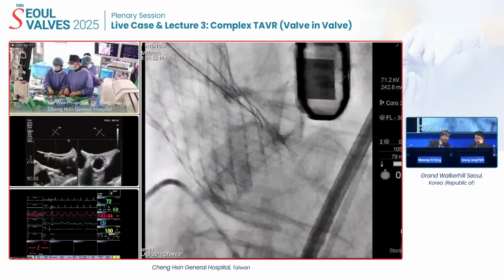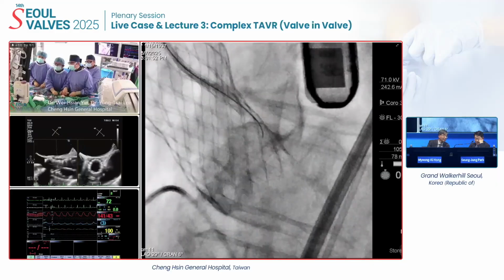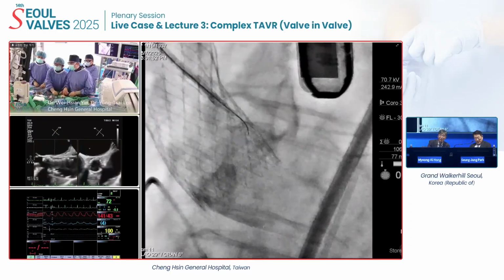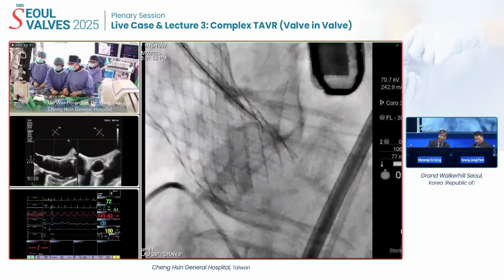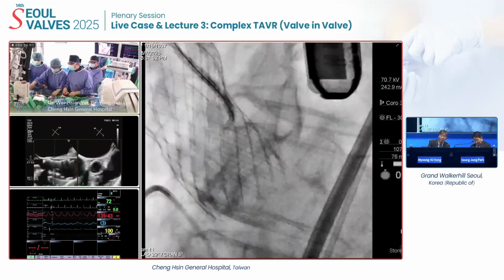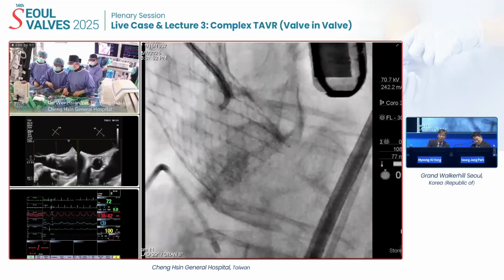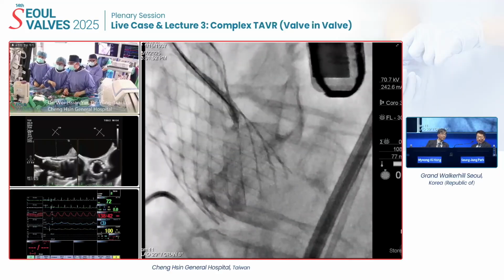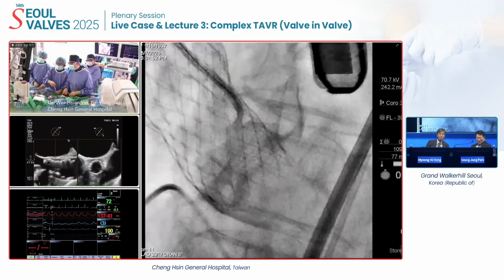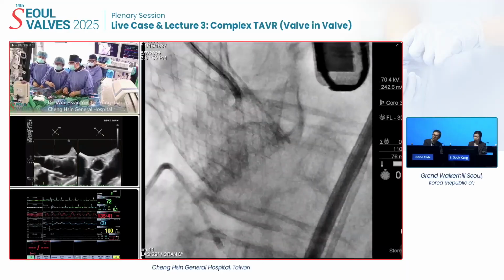The choice between unicorn and basilica, as mentioned before, depends on whether the leaflet is to be modified on one side or on both sides.